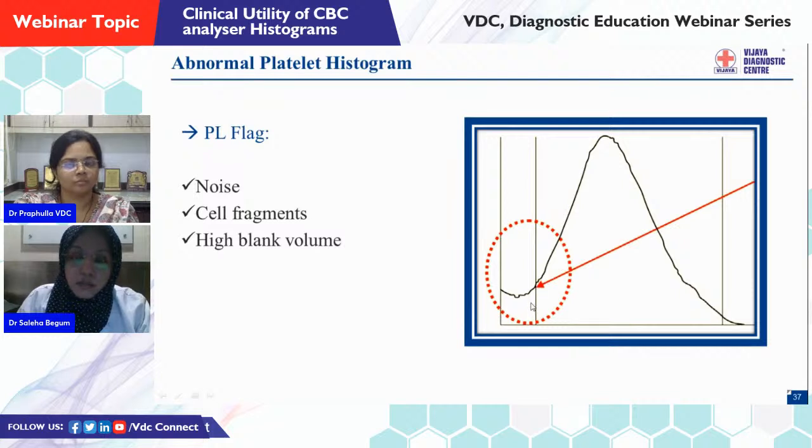It means that the lower discriminator here is set at 2 to 6 femtoliters, right? So there is something lesser than 2 to 6 femtoliters which is creating this abnormality in the graph. But as we know, in the patient blood there is nothing of less than a platelet size. Platelet itself is very small. So this could be any artifact such as noise, cell fragments, or high blank volume in the machine. So whenever we see such abnormality in the platelet histogram, we think of these things which are mostly technical, nothing to do with the patient sample except for the fragmented cells. Okay.